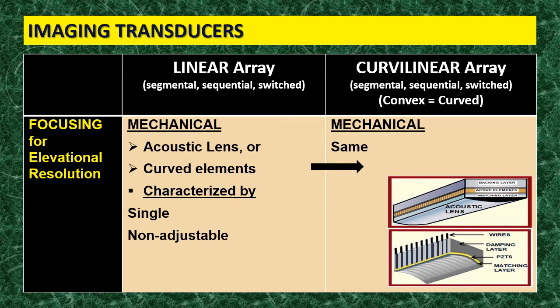Now we come to the elevation resolution. Elevation resolution needs focusing. Again, focusing here is like all the 1D transducers, the 1D family of transducers, 1D array transducers. The family of 1D array transducers are focused in the elevation resolution mechanically.